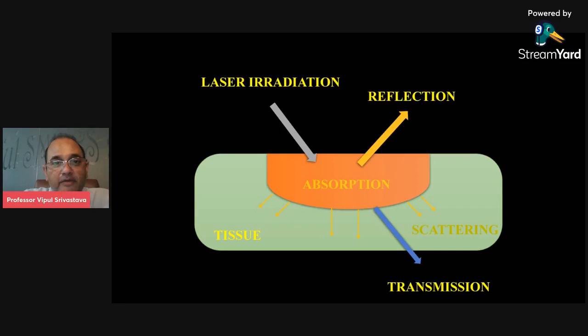If I'm doing hard tissue, it should get absorbed. If I'm doing soft tissue application, then also it needs to get absorbed. And what happens when they get absorbed, and where they get absorbed, I will be talking about in the next few slides. So we'll go here.